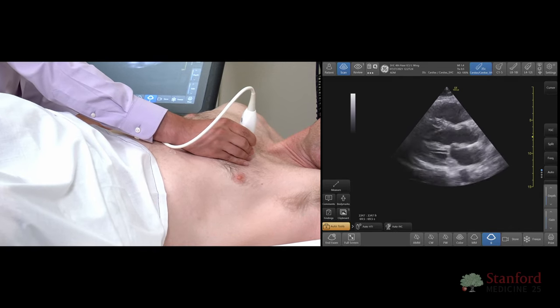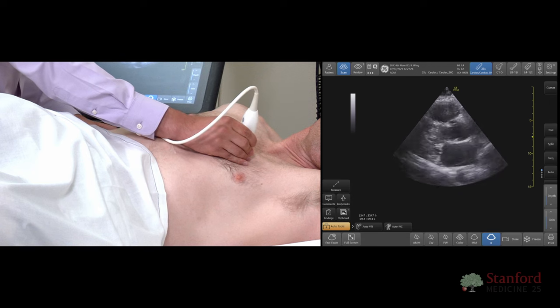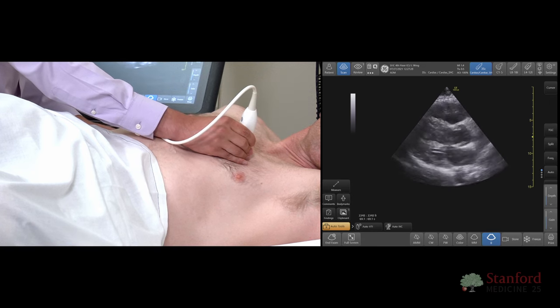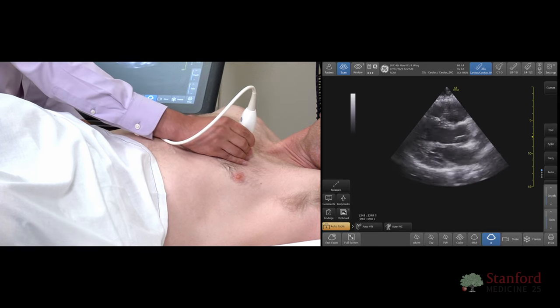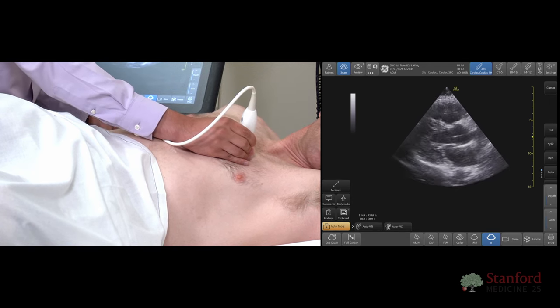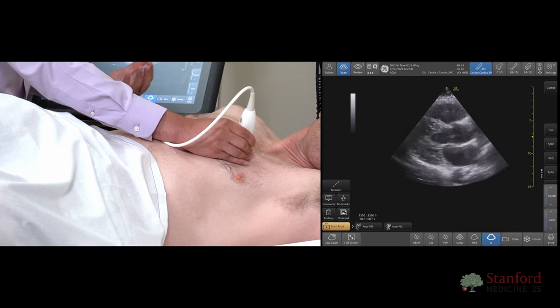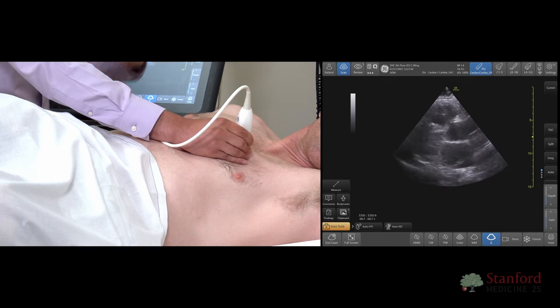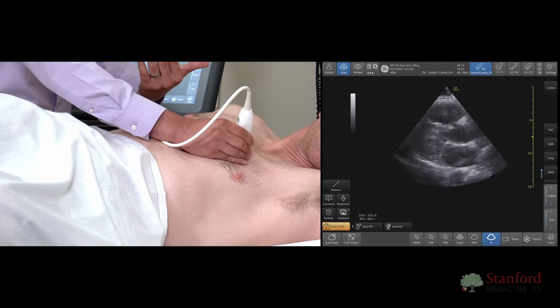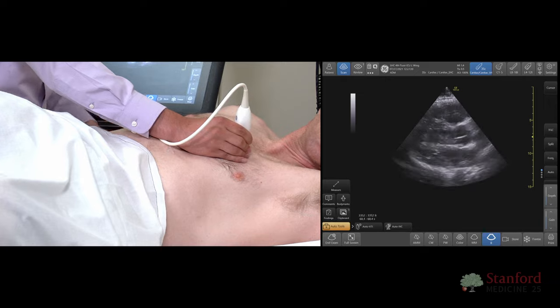By doing this, you're able to see a little bit better view of our left atrium, our left ventricle, and our outflow tract. Keep in mind, you may not be able to see the entire LV apex in this particular view, especially if you have them turn, but this is one particular trick.